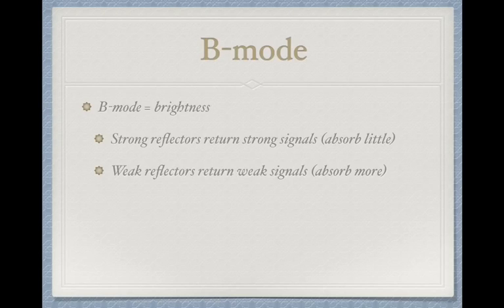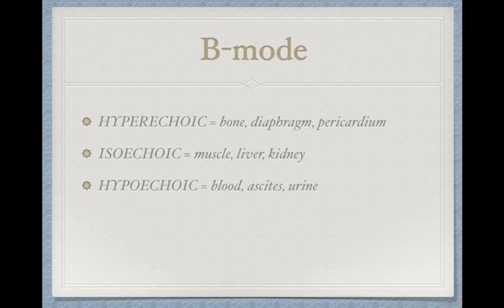That's going to be displayed accordingly on the screen, and that's where we get our terms hyperechoic, isoechoic, and hypoechoic. Hyperechoic is going to be a very strong reflector. It's going to come back very bright.